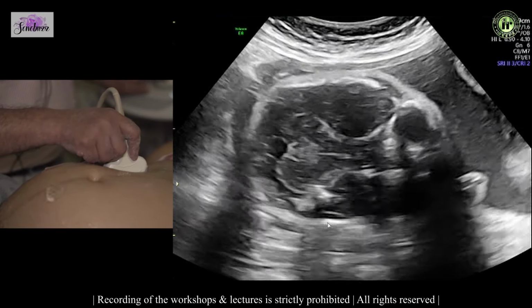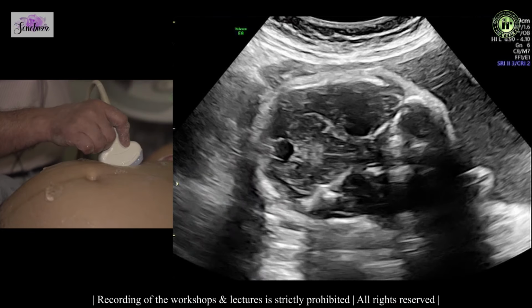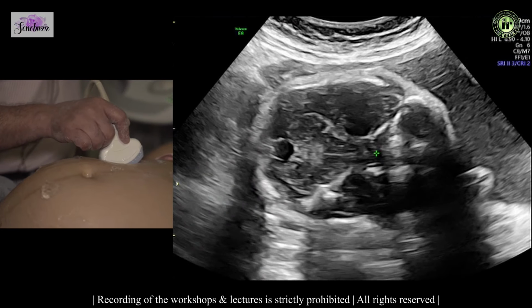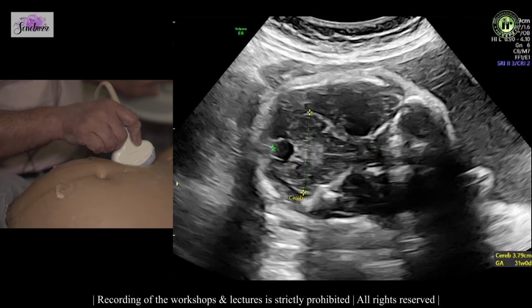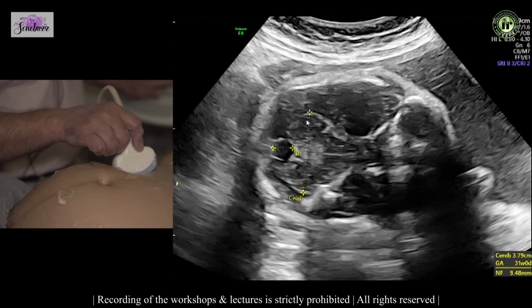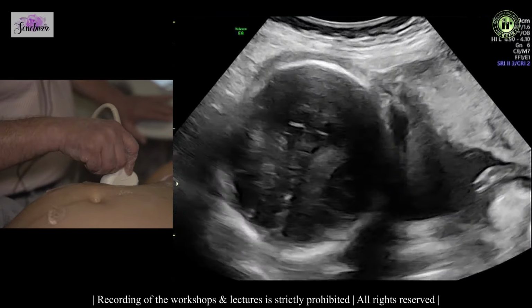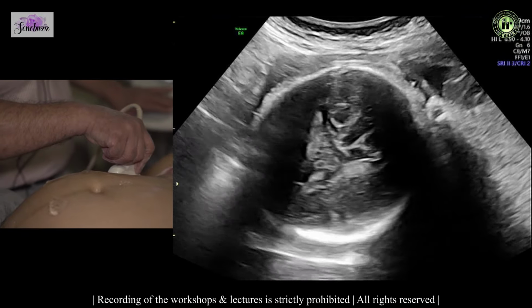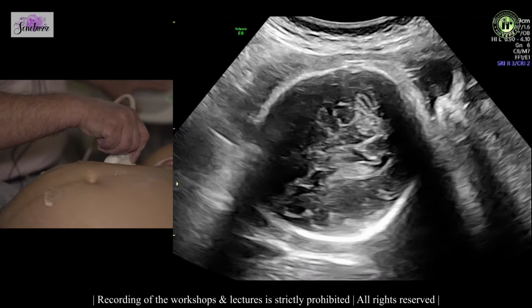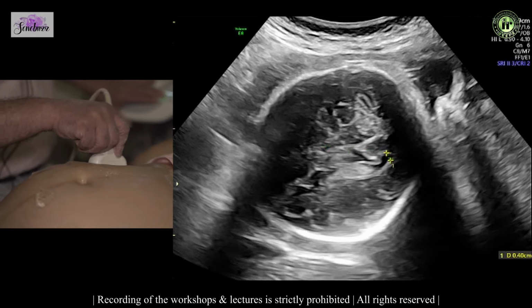And this is the axial plane. And the third axial plane is the lower plane, the transcerebellar plane, where we record the transcerebellar diameter, the cisterna magna, and we look at the vermis. So the vermis is echogenic, the cerebellar hemispheres are hypoechoic. So these are the three basic axial planes. As the fetus is moving, we can see the opposite ventricle also. You can notice the size of the opposite ventricle.